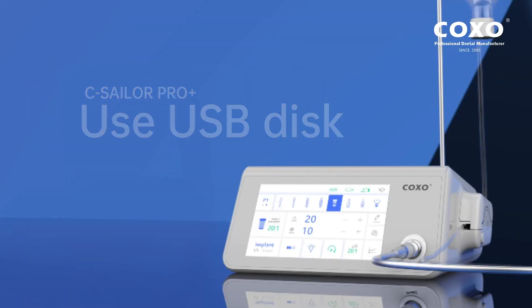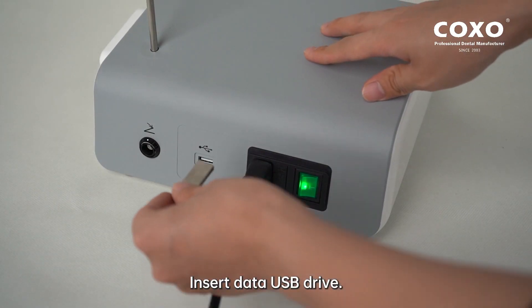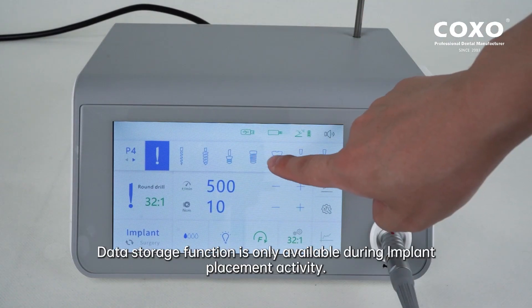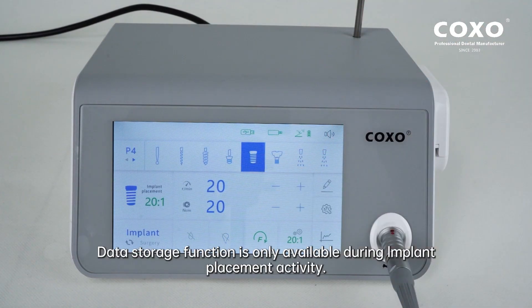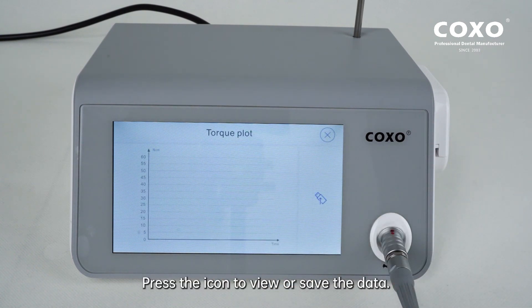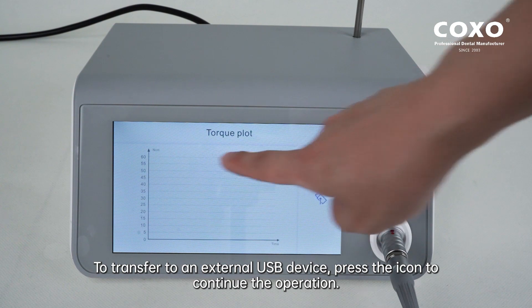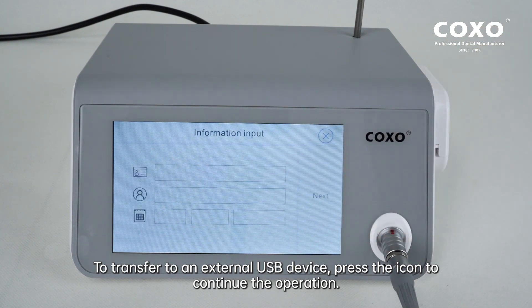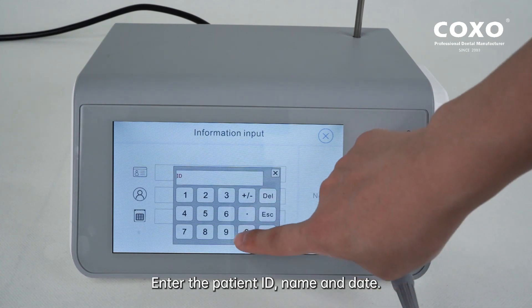Use USB disk: insert the data USB drive. Data storage function is only available during implant placement activity. Press the icon to view or save the data. To transfer to an external USB device, press the icon to continue the operation. Enter the patient ID, name, and date.